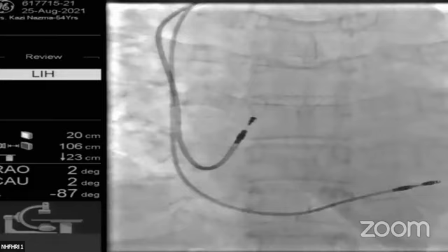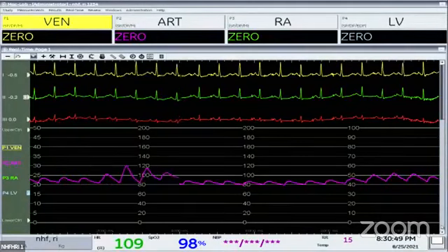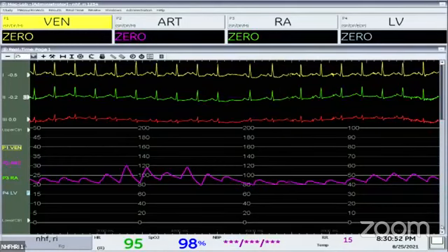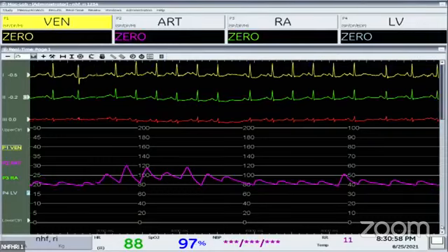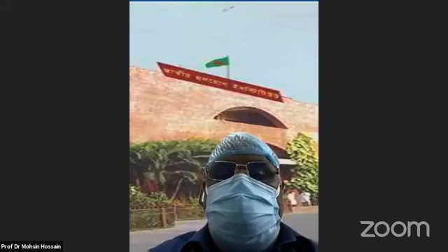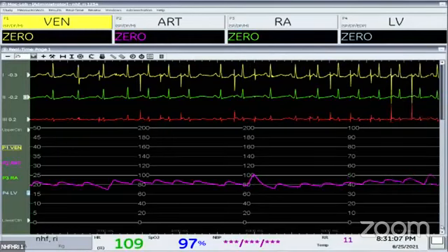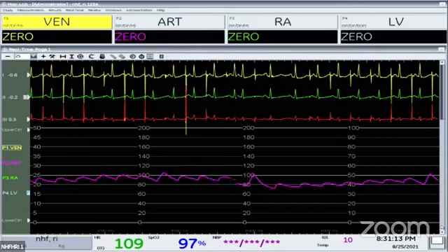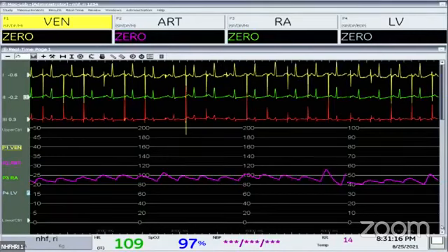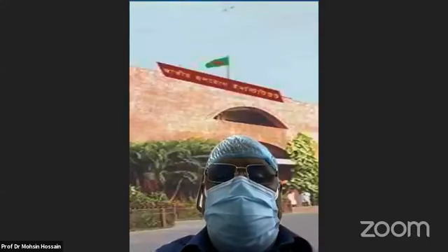Yes, so this is pacing regularly. ECG monitor, please. If you see, there is a spike in the AAI mode. There is a spike followed by a P wave. So before the P wave, there is a spike. I put the clip on the skin, so the spike is big. The pacing spike of the atrium is big. It should be checked in the AAI mode, the atrial lead.